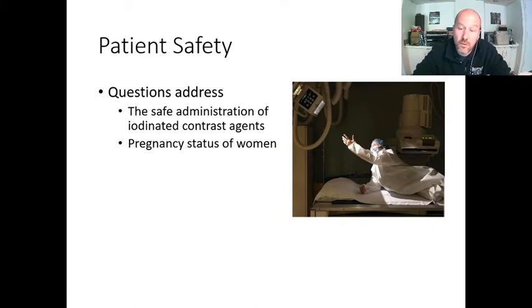Or, are you pregnant? Is there a chance you could be pregnant? Have you been trying to get pregnant? Those types of questions, it's like, hi, my name is Ben. Any chance you're trying to get pregnant? Figure out ways to kind of break the ice a little bit, but they should understand why you're asking, and it has to do with radiation.